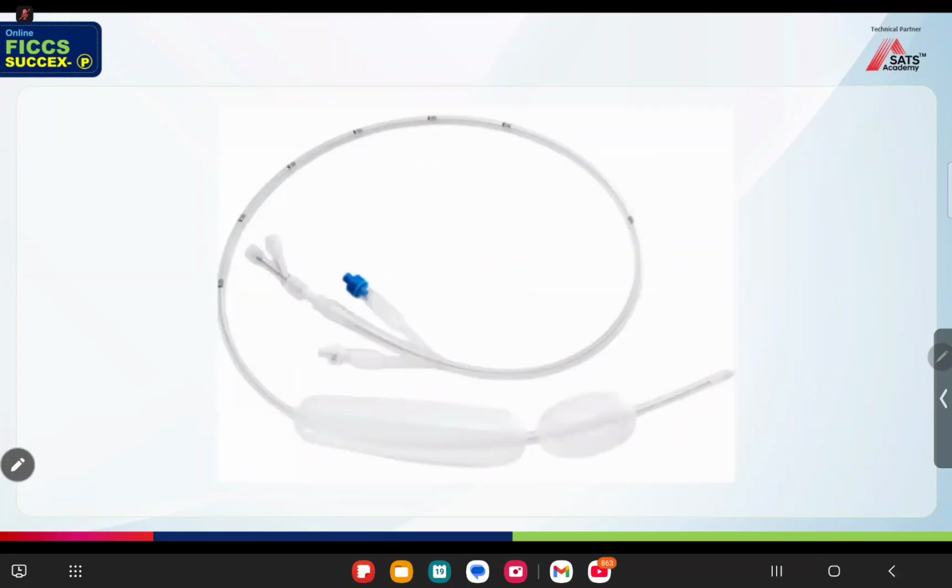What is this? This is a Sengstaken-Blakemore tube. Very good. Next question. What is the use of Sengstaken-Blakemore tube? Controlling upper GI bleed by tamponade effect, compressing the esophageal-gastric junction, compressing a variceal bleed, ma'am. So we are using it in all the patients?